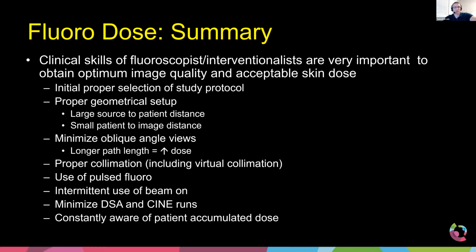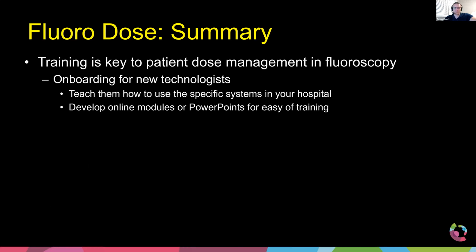And then of course we just watch. We have the cumulative air kerma at the reference point displayed on the monitor. So as we talked about in our last Q&A, you just keep an eye on that to make sure the doses aren't creeping up too high.